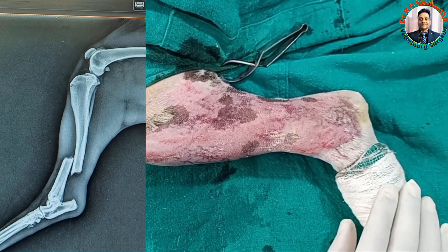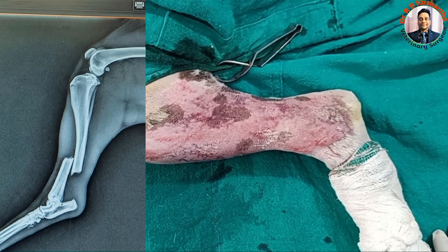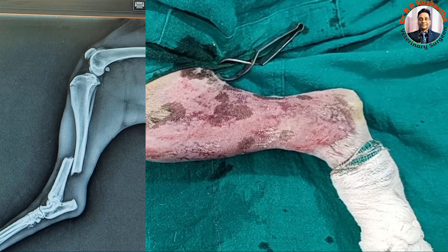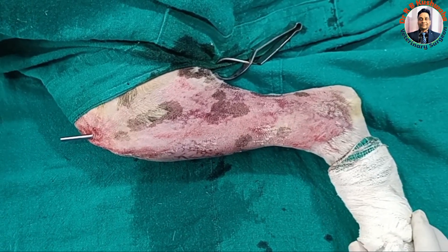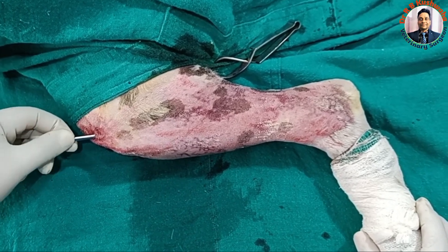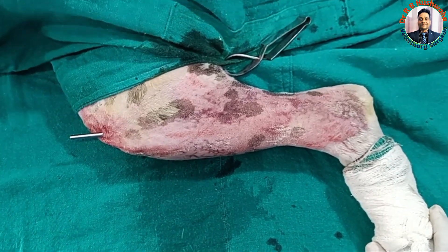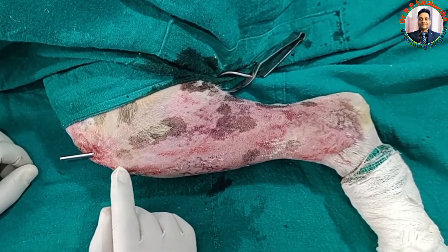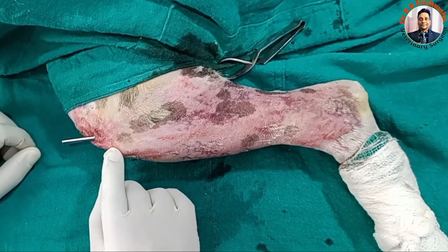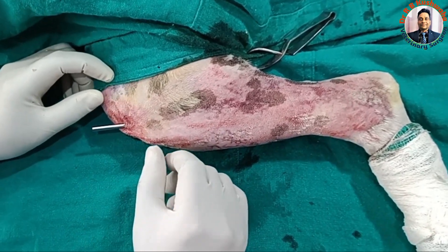When the fracture is transverse and in two pieces in the case of tibia, I prefer closed reduction with normograde intramedullary pinning. As you can see here, this is a 4.5 mm Steinmann pin. I have just performed this procedure. The most important part in normograde pinning with closed reduction is identifying the point where the pin is to be inserted.